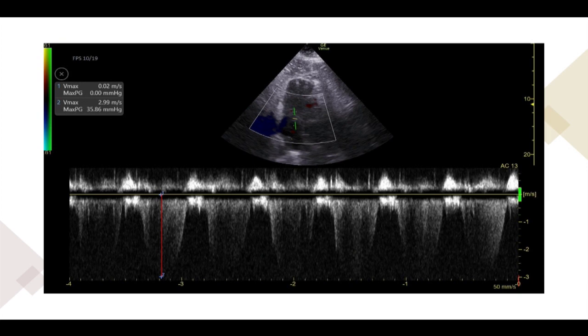So to show you how that works here, this is the pulmonic artery systolic pressure. And like I said earlier, you bring that apical four chamber view. This one is not the best apical four chamber view, but this is the right ventricle right here. We activate the continuous wave, and then we will measure pretty much from baseline to peak. If it's less than 60 millimeters mercury, it's an acute process.